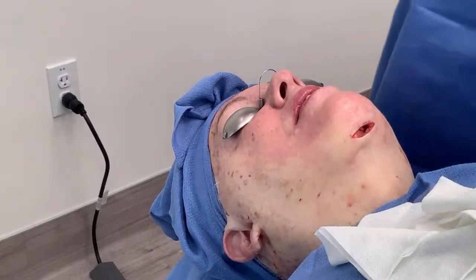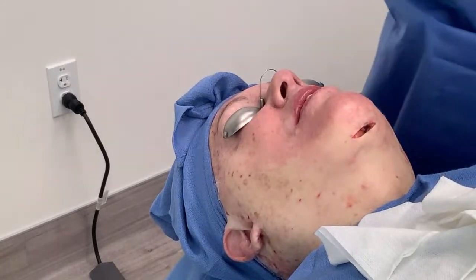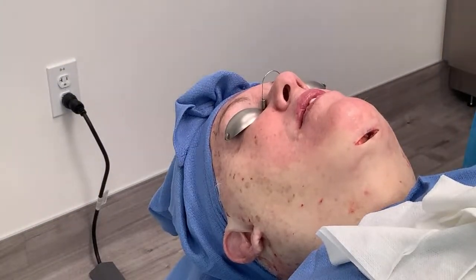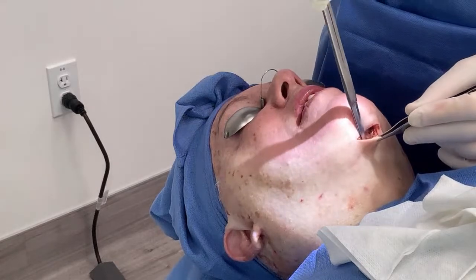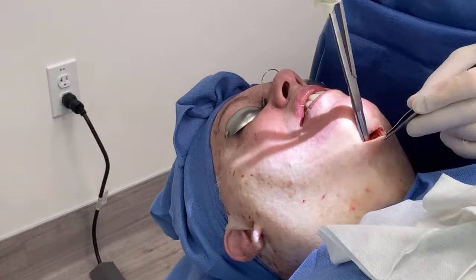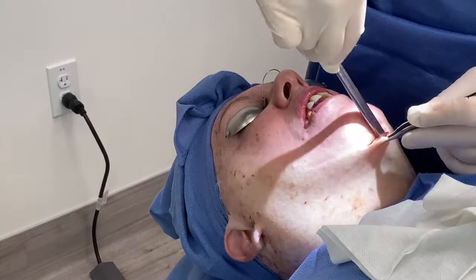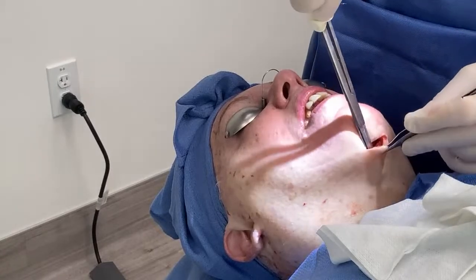I'm going to give this to you, Jamie. So for my physicians and students that are watching, now that I've done the laser lipolysis, we elevate into the subcutaneous plane. Very good. Perfect.